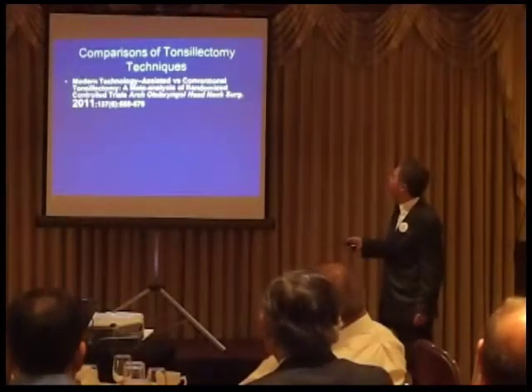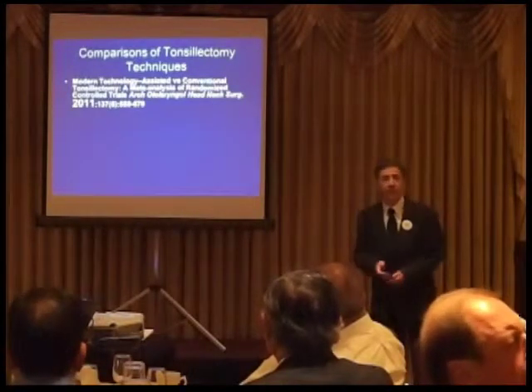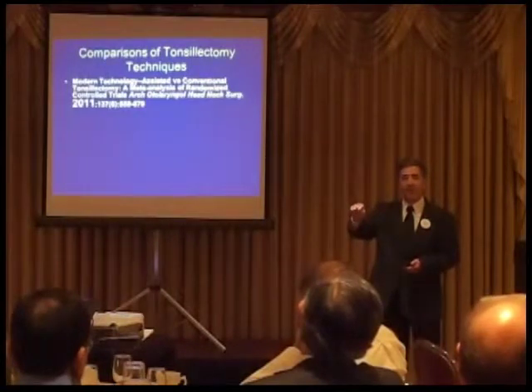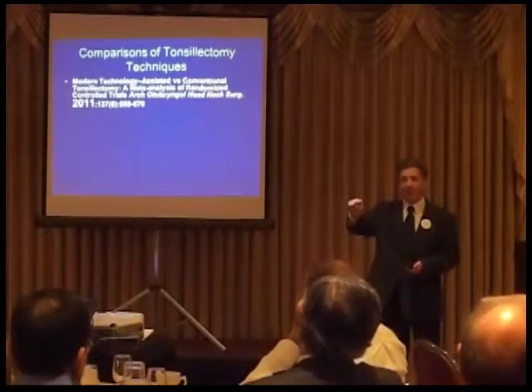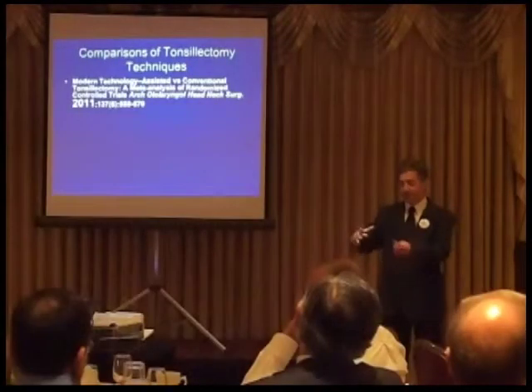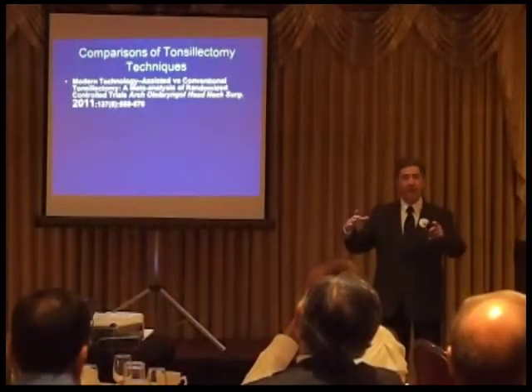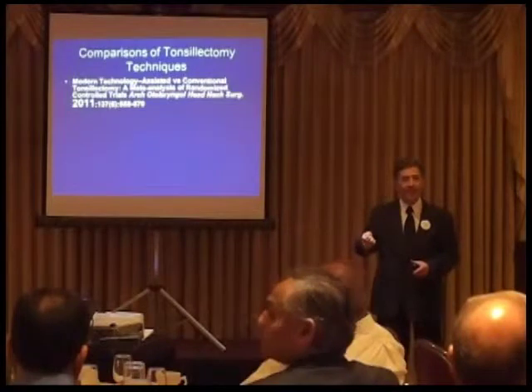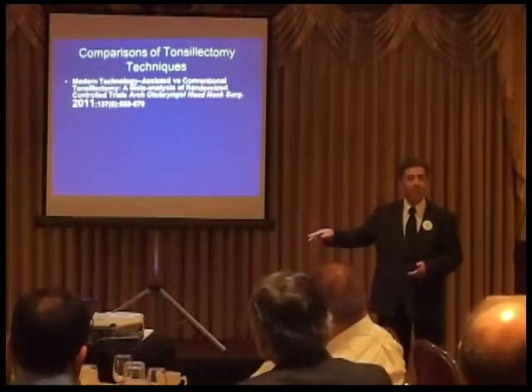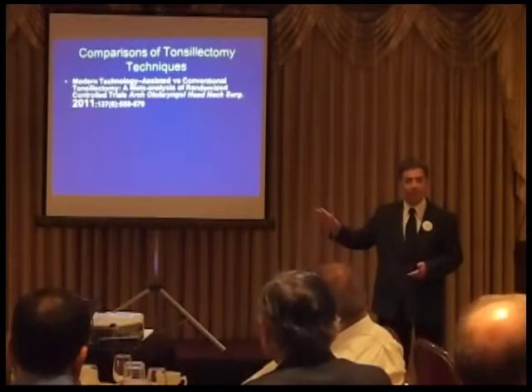So anyway, the heat is provided for what? I don't know how it's provided. It ends up being almost trivial. It's just a heating element connected to a little box. So in terms of setup, it's plug it in, put the foot pedal down, set the level at what I want, and you're done. That's the total setup. It's a cord.